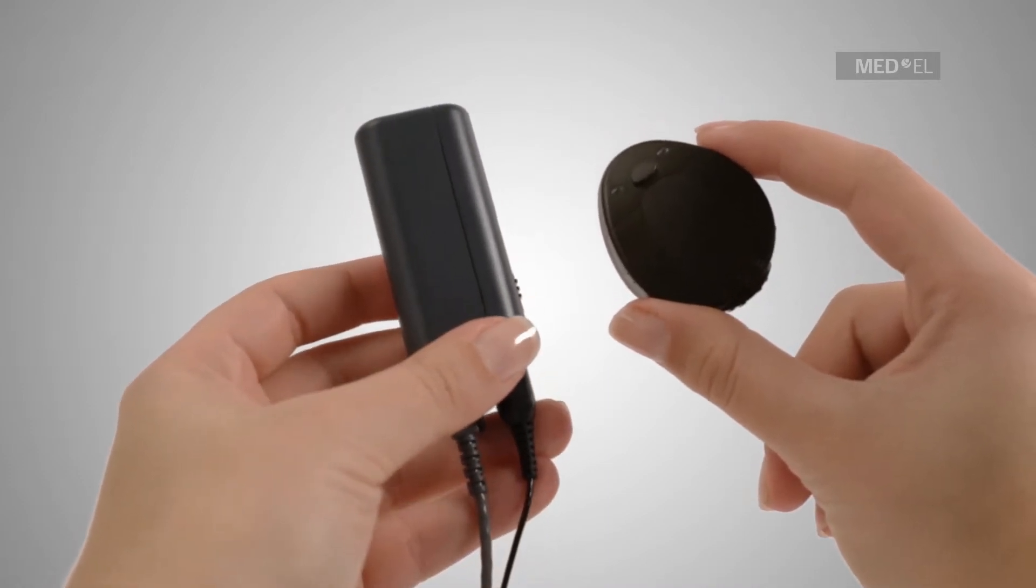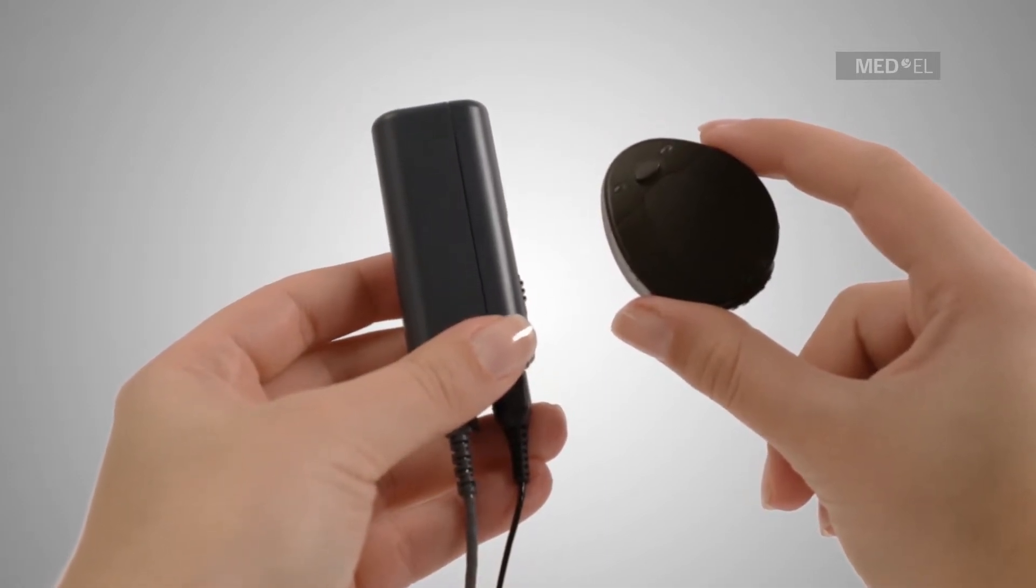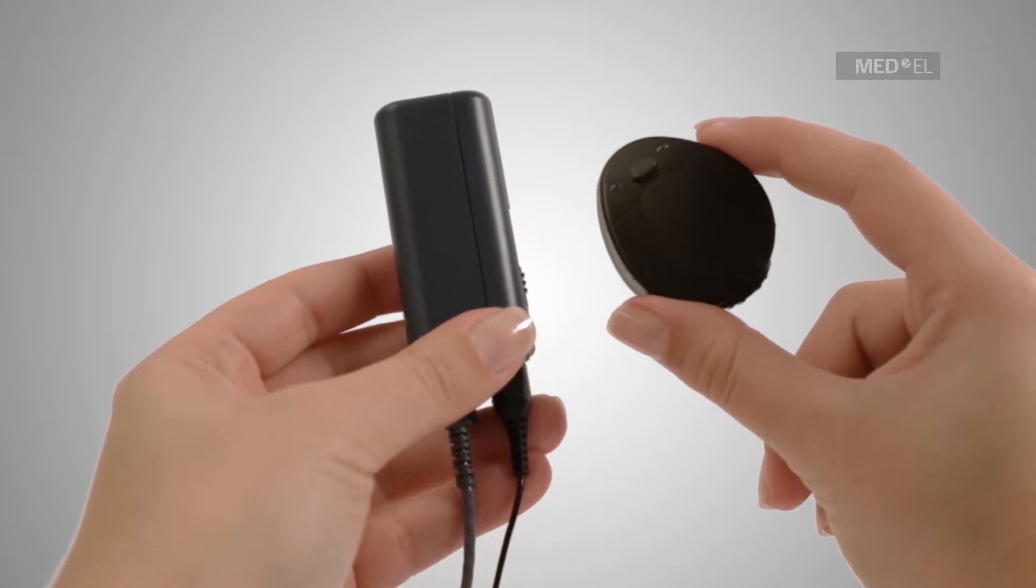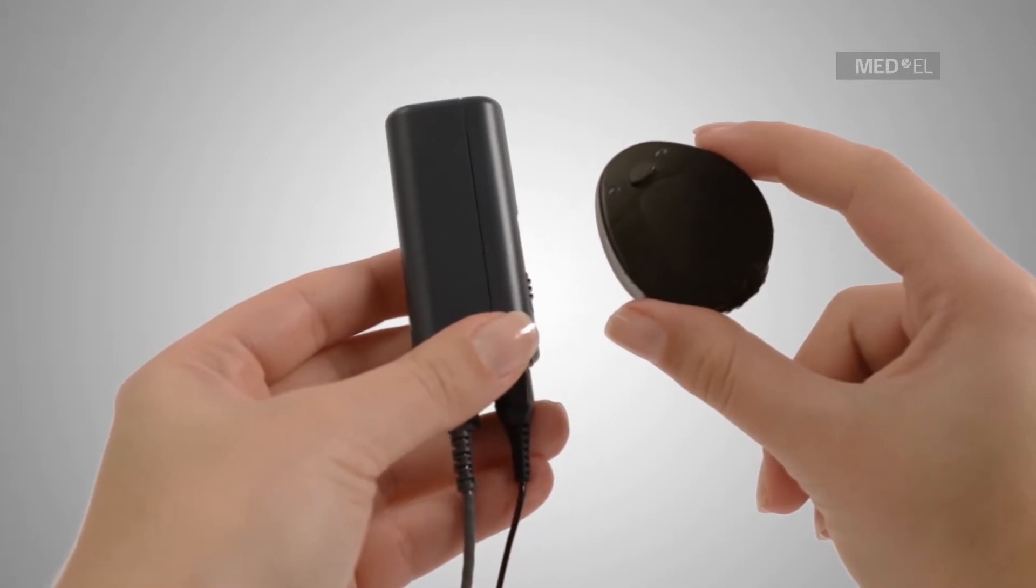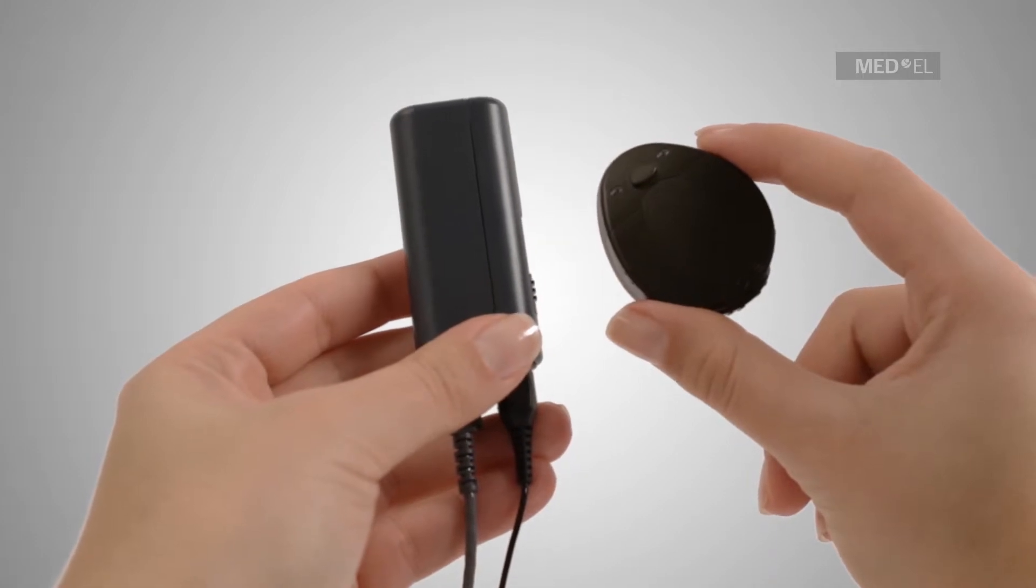The Mini Battery Pack is an alternative external power supply with additional connectivity options and is connected to the RONDO control unit via a connection cable.